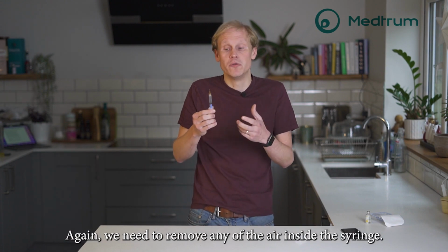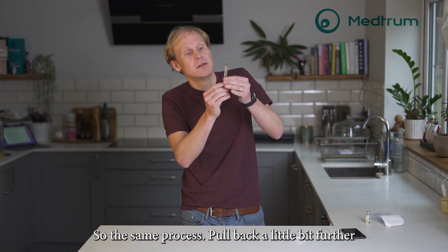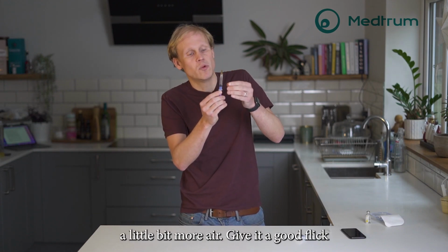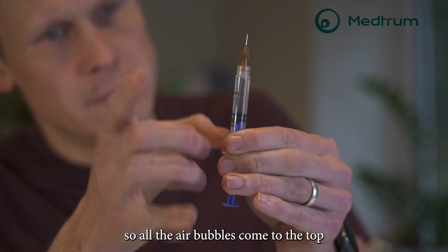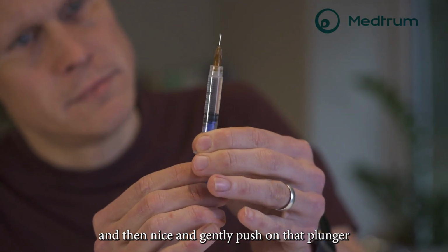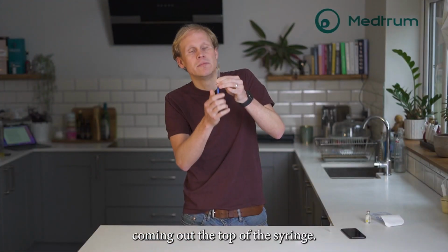Again, we need to remove any of the air inside the syringe. So the same process. Pull back a little bit further on the plunger to introduce a little bit more air. Give it a good flick, so all the air bubbles come to the top, and then nice and gently push on that plunger until you get a few drops of insulin coming out the top of this syringe.